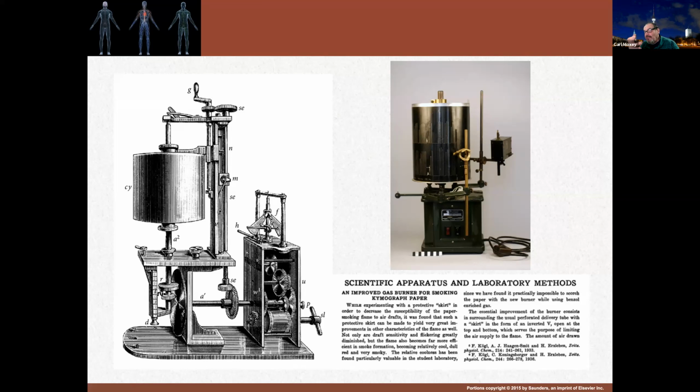And that was the way in which you recorded it. Now, this meant that there were several interesting little things one had to do to perform this kind of operation. One of them, of course, was to produce the smoked paper in the first place, which meant that you went and took this paper and held it over a burning tub of hydrocarbons. It was really a very disgusting kind of thing.